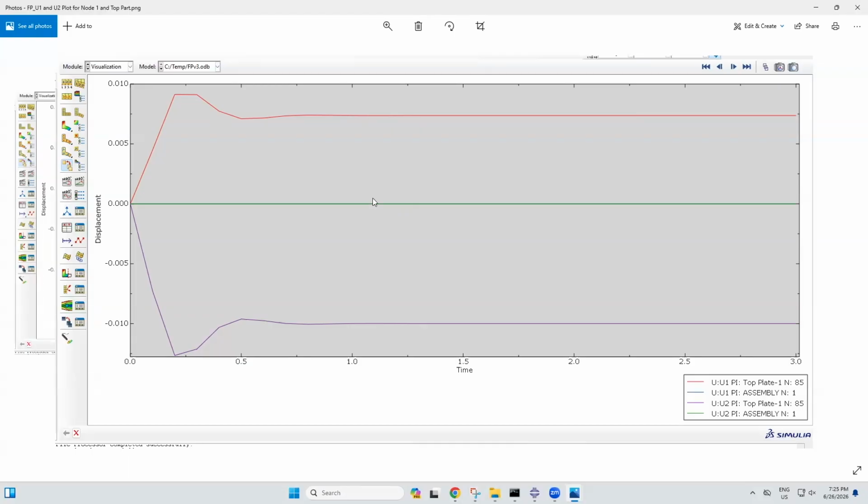For the vertical displacement, we can see that the ground reference point is also 0 because we constrained it in that direction as well. However, the vertical displacement for the top plate is negative, and we can see that it is the opposite of the horizontal displacement, as it is negative when the part is initially deformed, but will become less negative as the part reaches a state of equilibrium. And here we can see the part has reached equilibrium as it is steady and constant.